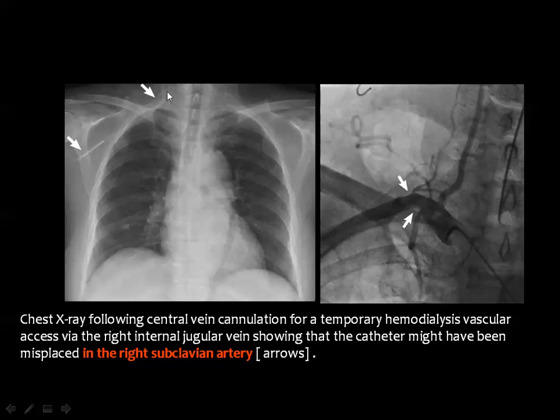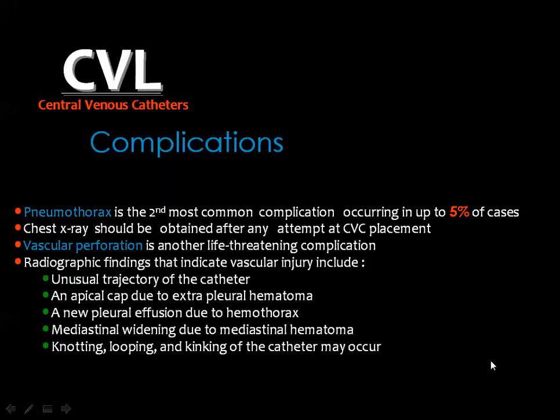You put the catheter through, let us say this is the subclavian artery, and the catheter goes down to the axillary artery, which is confirmed by selective catheterization of the innominate or the subclavian artery through the femoral approach.